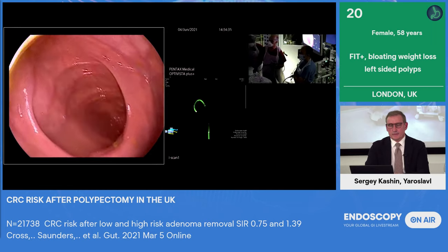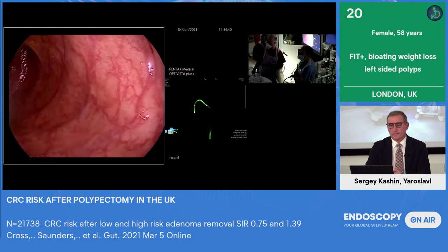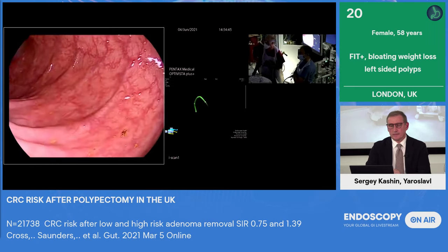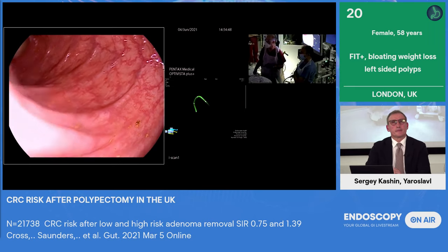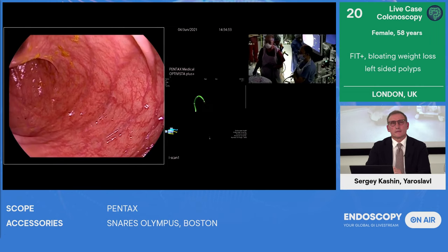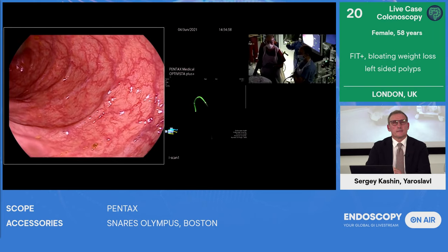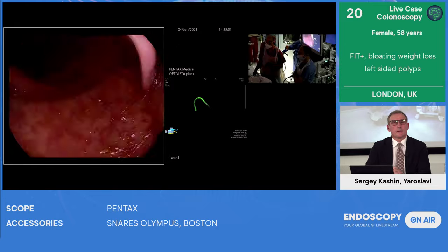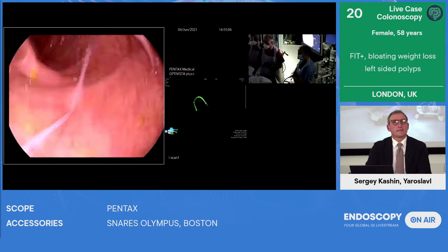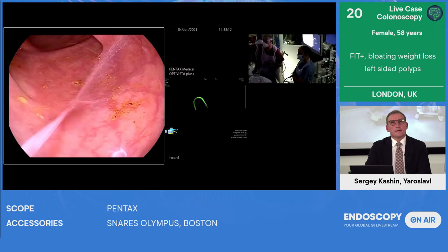When I'm manipulating the scope, I can feel that the sigmoid is still slightly fixed and slightly angulated from the diverticular disease. So we have to be careful. And when you're intubating a difficult colon with a fixed sigmoid, you have to be careful, not just during the insertion, but also during the withdrawal. If you pull back aggressively or quickly, you can cause a mucosal tear or a perforation. So just very slow, controlled movements. And we're just manipulating using the washing pump. Here, the washing pump sort of at 7 o'clock, just to wash the mucosa.